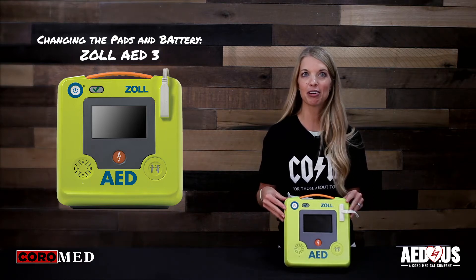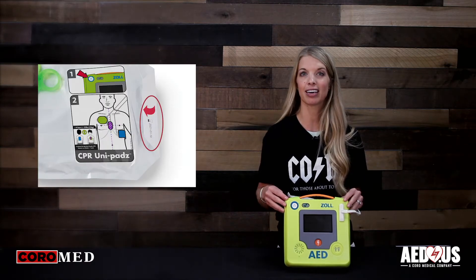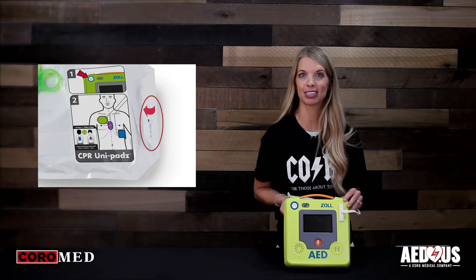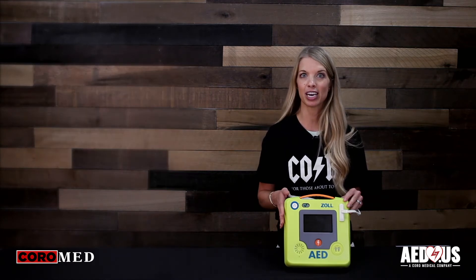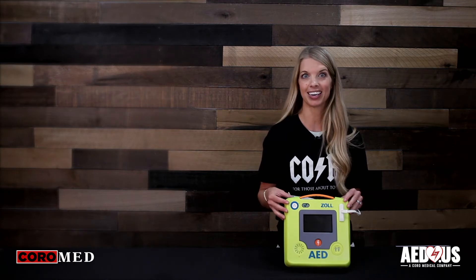To prepare for an emergency, you want to make sure the electrodes are connected to the unit at all times. This AED uses one set of pads for both adult and pediatric. The pads have a five-year expiration, and the expiration date is located on the outside of the package. You're going to change the pads at the time of expiration or if you use the AED.